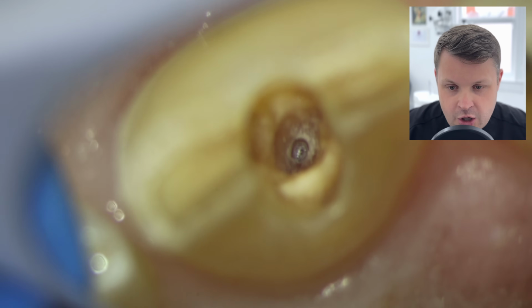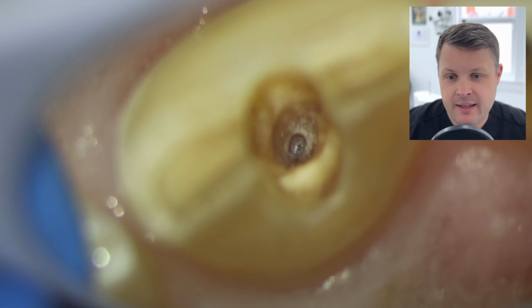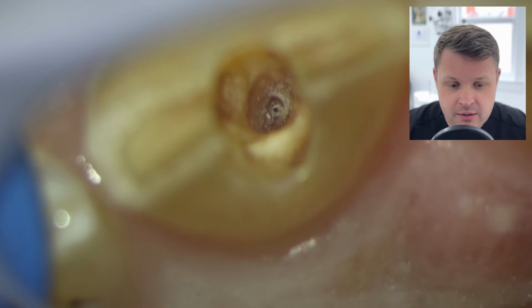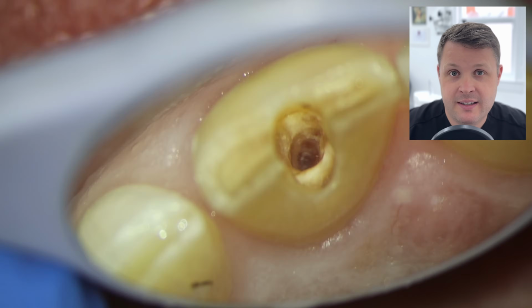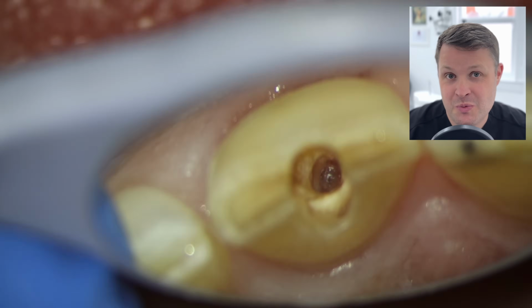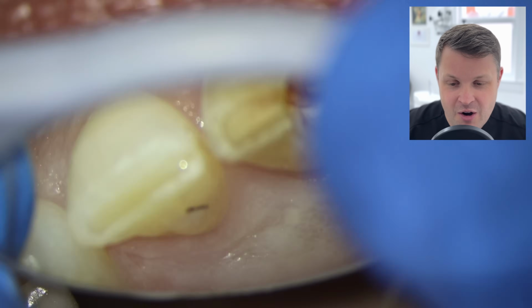And on reflection, again, I feel like I didn't see this at the time, but I am definitely off center here, mainly because I'm following the darkness. The argument, of course, is there's no obvious white sclerosed tissue here, so you've got to use your common sense, and sometimes in these cases we are in the right orientation, and we do get the correct orientation of the instruments to get into the orifice.